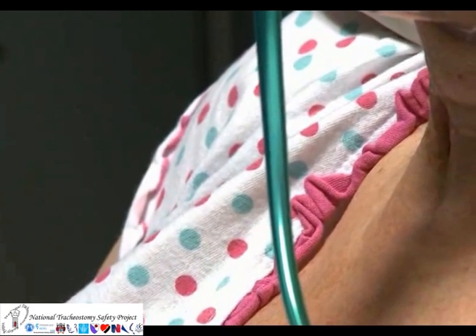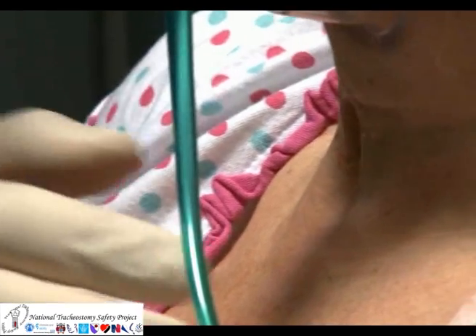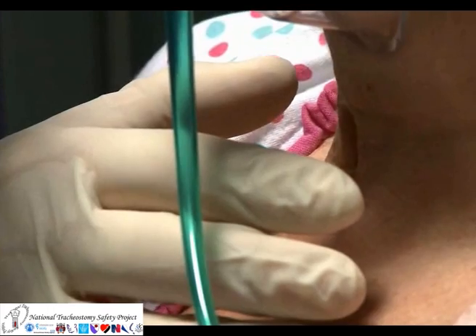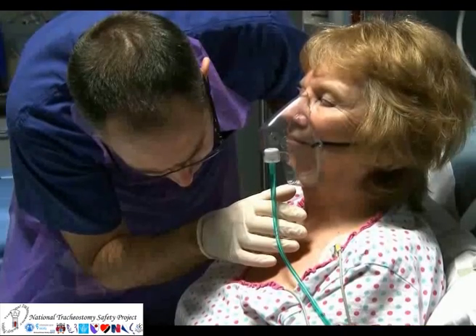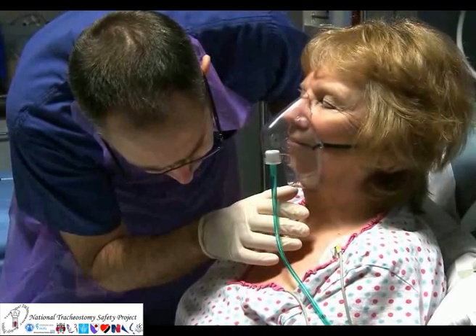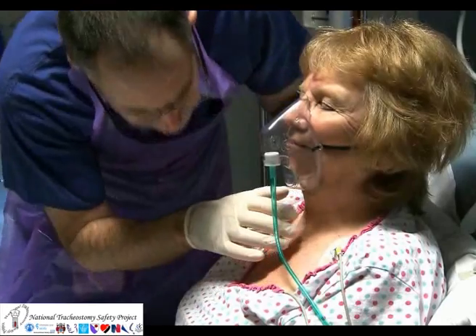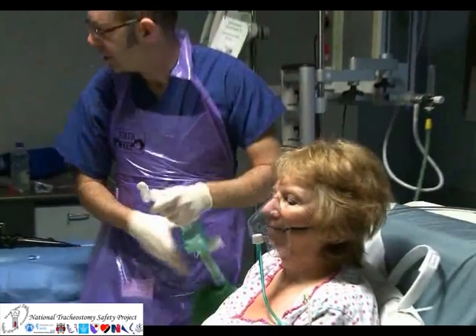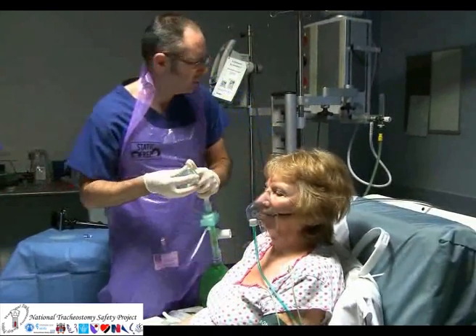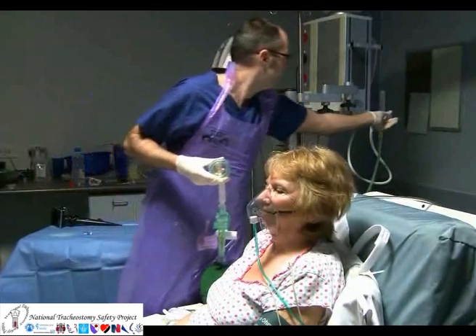A reassessment then takes place, both at the tracheostomy stoma and at the upper airway, to see if there is gas now moving through either of these airways. Oxygen should be reapplied to the face and to the tracheostomy stoma.